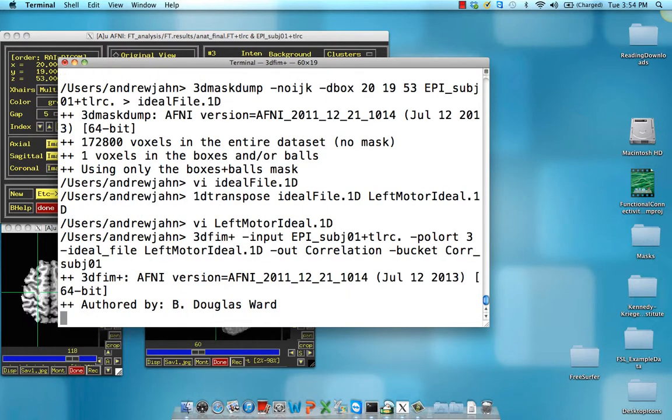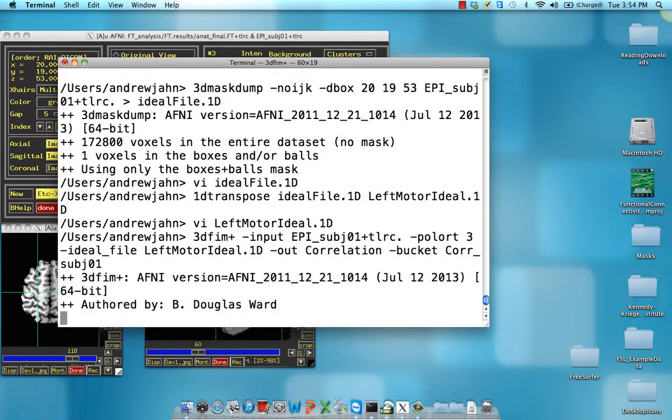So hit that. It takes a few seconds to process. And now we have our correlation map.